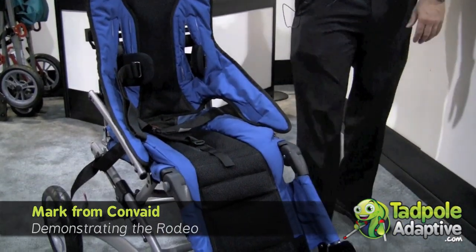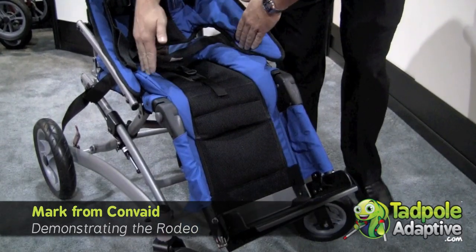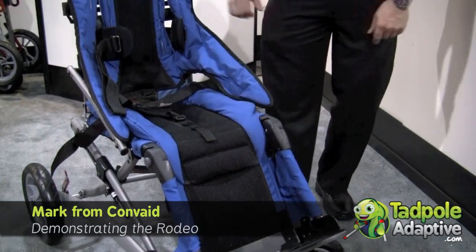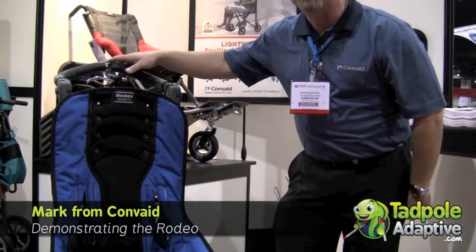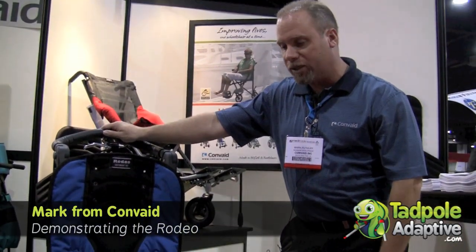It comes in four sizes now: size 10, 12, 14, and 16 inch wide. It is also a crash-tested chair that you can get with transit brackets to lock down aboard a bus or public transportation.